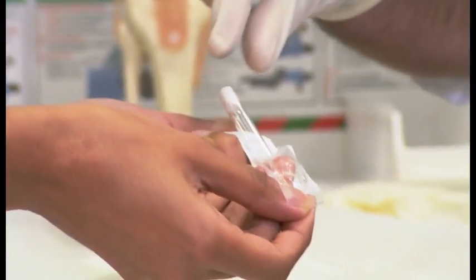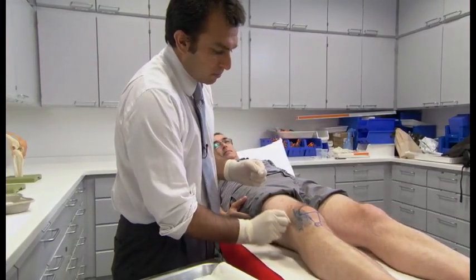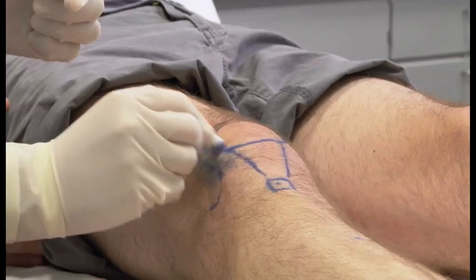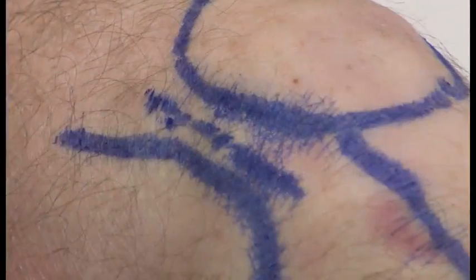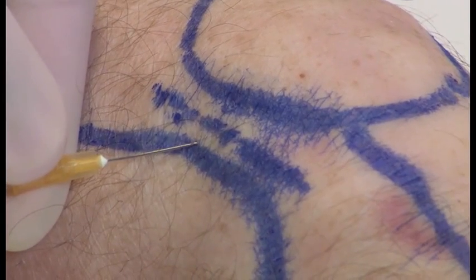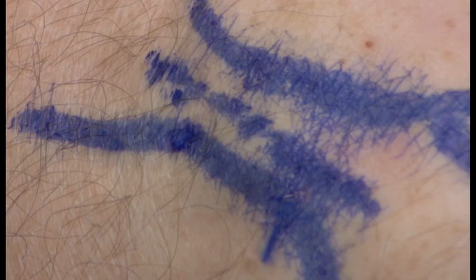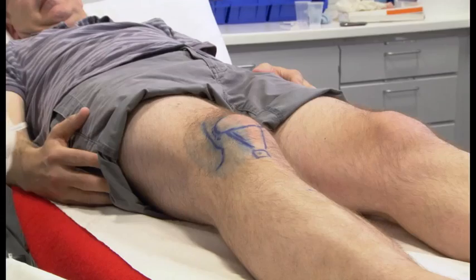Okay, so before injecting, we prep the skin with ChloraPrep containing chlorhexidine solution. One then administers the local anaesthetic into the skin and subcutaneous tissues to ensure maximum pain relief. All one does is insert an orange needle, which is a 25 gauge needle, beneath the skin and just raise a bleb. A couple of millilitres is usually enough. Give it about a minute or so to take effect, and then the patient has complete anaesthesia in that area.